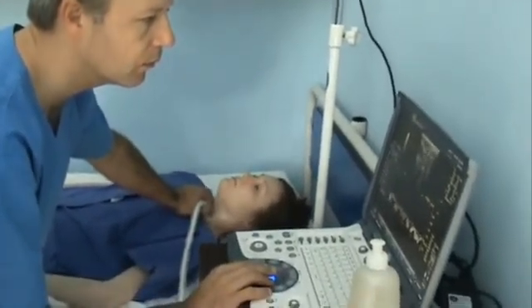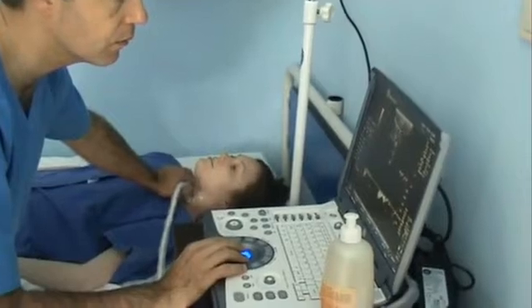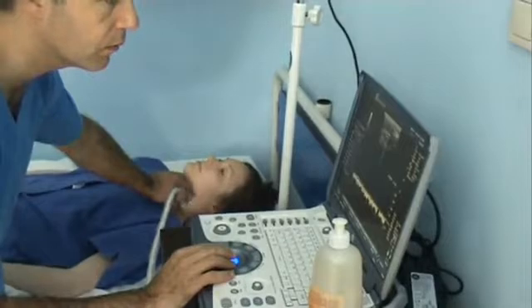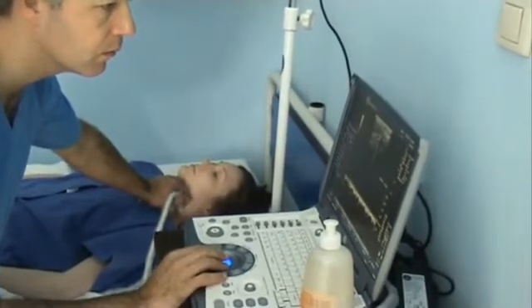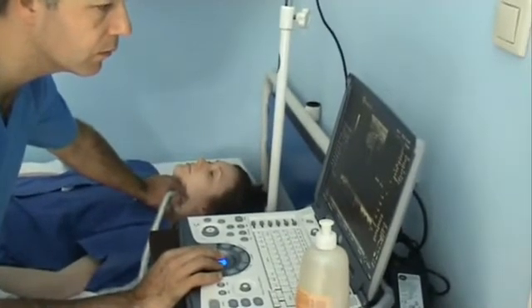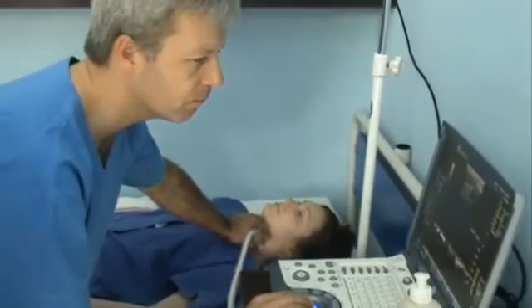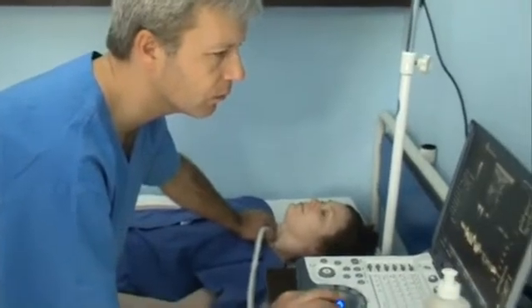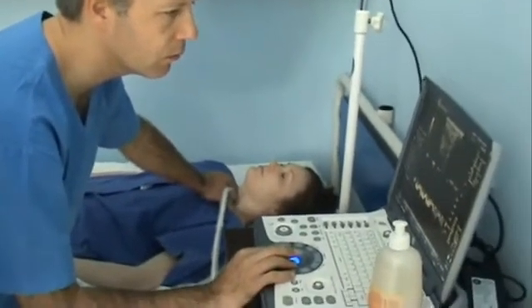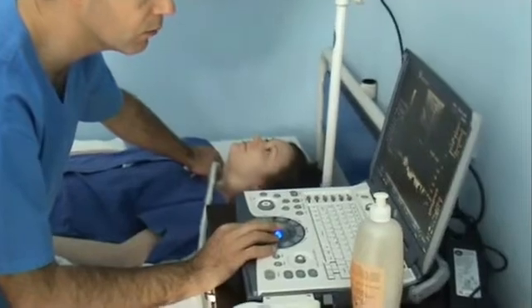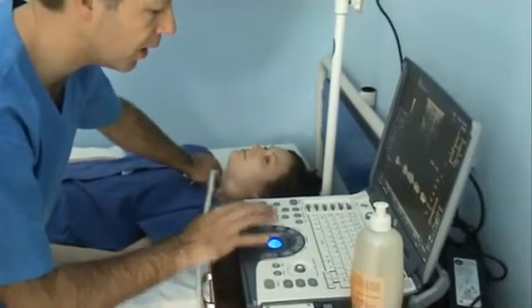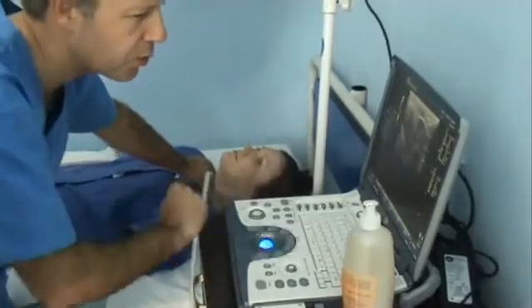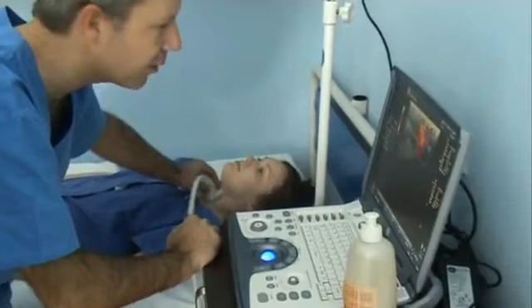Good morning. So, this left side looks normal. There are some fluctuations, but I don't think it's a real pathology.